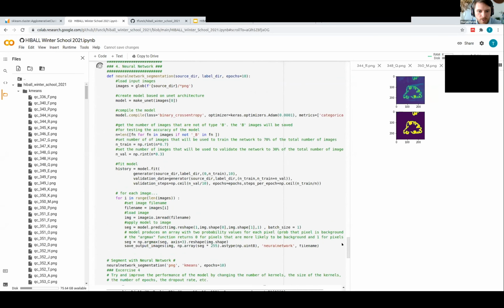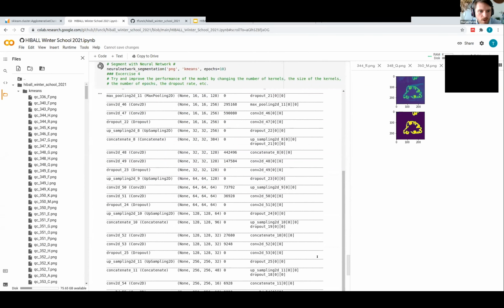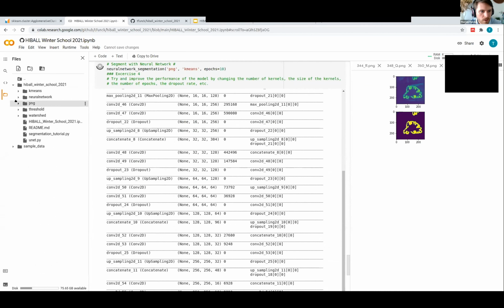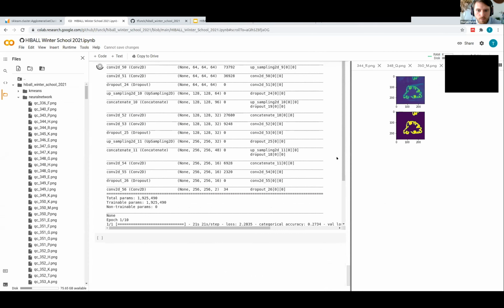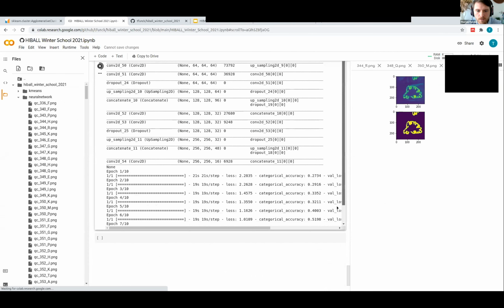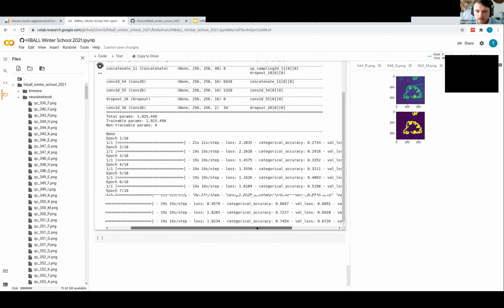And so those are completely new to the model when at the end, the model gets applied to all the images. So afterwards, what you can do is go check the results on those B images. And those are images that the model has never seen before. And so it shows you to a certain extent that this sort of neural network can generalize to completely new data or to relatively new data. And so I think that's kind of a neat feature of this.